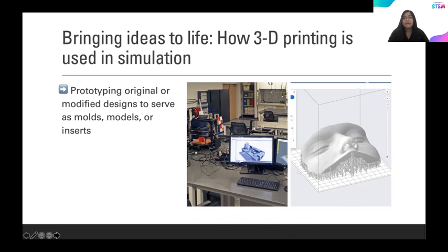So here you can see a CAD file of our cricothyrotomy holder. If you've never heard of cricothyrotomy before, it's a difficult airway procedure needed in order to properly intubate a patient if it's difficult to intubate them in the normal way. On the right, also, you can see a patient-specific face model, which we have used for an ear, nose, and throat research project that we have done here in the ASTEC lab.